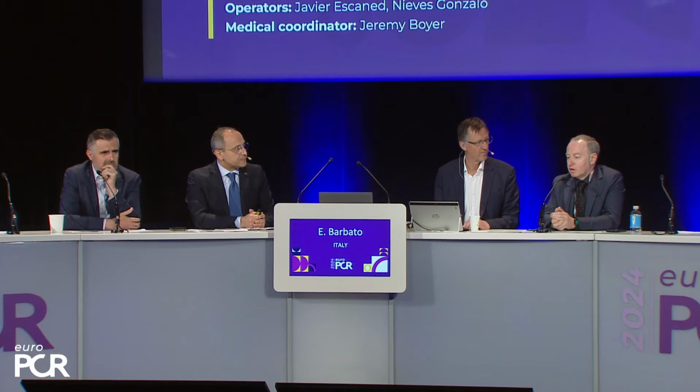While you are reflecting and giving back to us your feedback, I will start with Peter, asking the same question. Sure. Access, guiding catheter size and types, and kind of plaque modification tool that you would like to adopt here. Perfect. Access choice, I would take a 7 French system if the patient could tolerate that, because I think it gives more options, particularly when we're talking about stent strategy. And I would be using an EBU, some sort of backup guide for extra support. And I would have all the calcium modalities available on offer, because until you've got perhaps imaging or perhaps you've experienced how difficult it will be to deliver, you don't know which one you're going to choose.